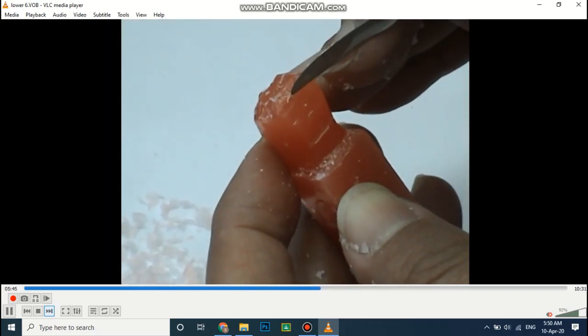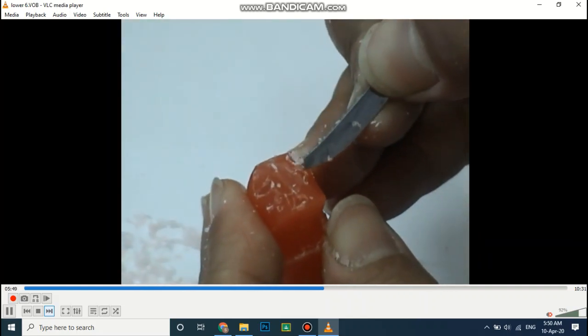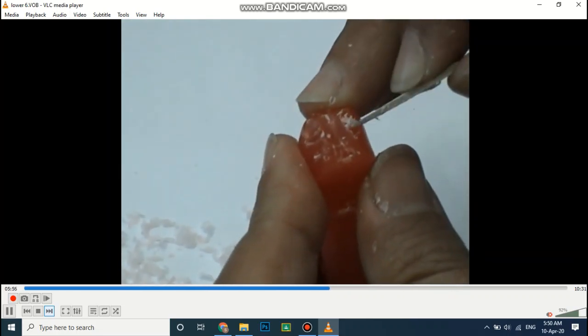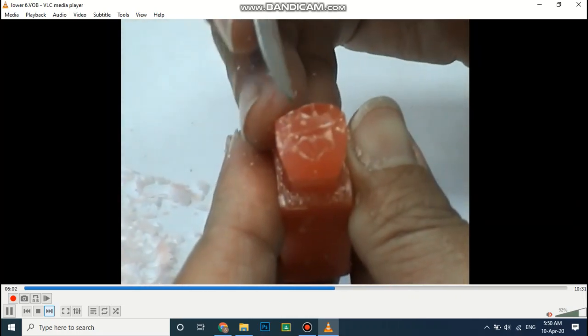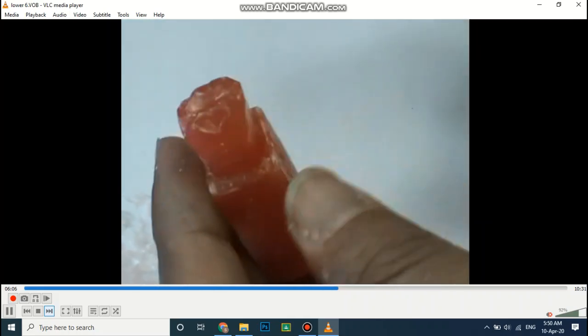Thus, the V-shaped notch to separate the cusps has a depth of just 2 mm from the cusp tip. By this way, we have 5 cusps with 5 cusp tips: distal, distobuccal, mesiobuccal, mesiolingual, and distolingual.